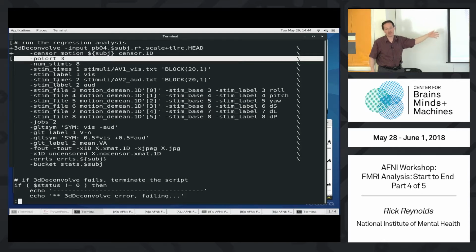So you can say bandpass to use the high pass filter where you remove the lower trends. And you can use the same cutoff that is applied in FSL or SPM. Anyway, you can ponder how you do that. But then afni_proc would create the sinusoids for you and stick them in here, so that you would do that with a band passing option, if you wanted to.